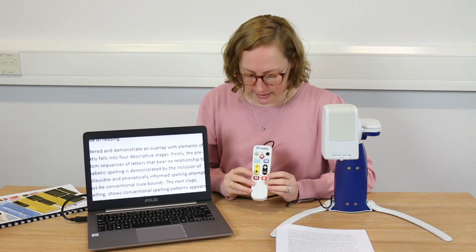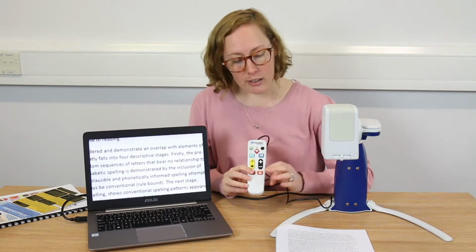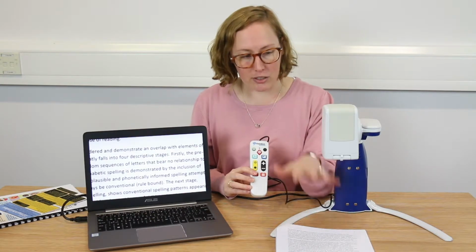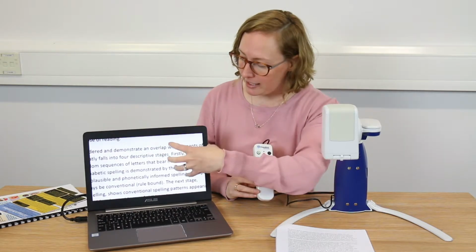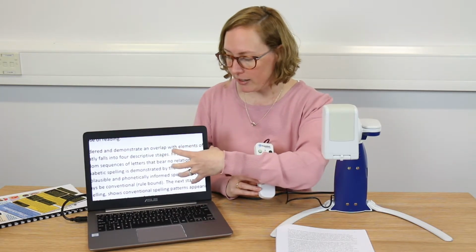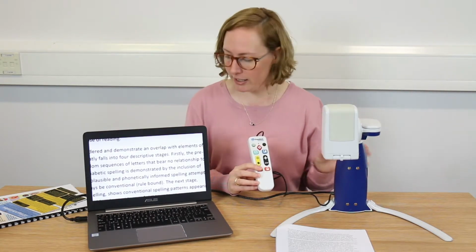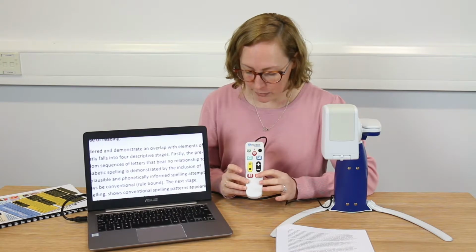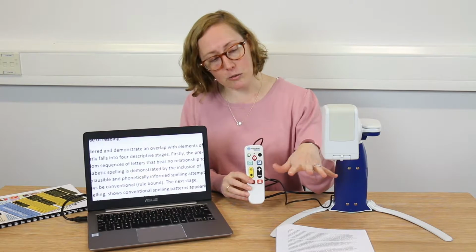We've got 2 more buttons just at the bottom here. We've got a freeze frame, so you can use it to freeze the image on the screen, so that then this paper could be taken away and used by somebody else. And again, because it's connected to a computer here, I could save that image to my computer, or we actually have an SD card slot built into the side of the device here, and you can save the images to the device.